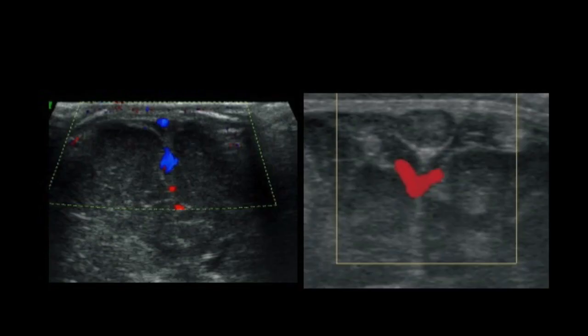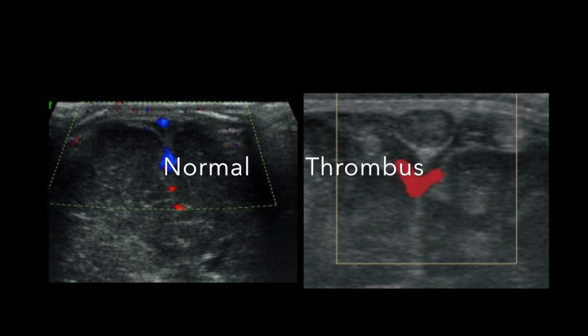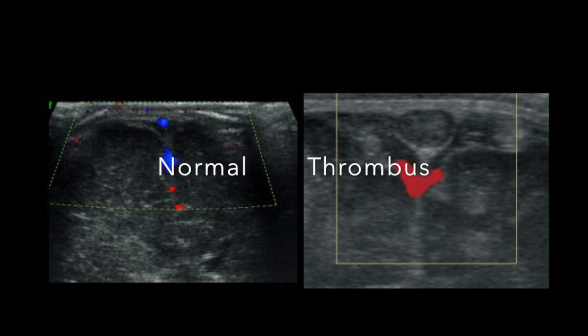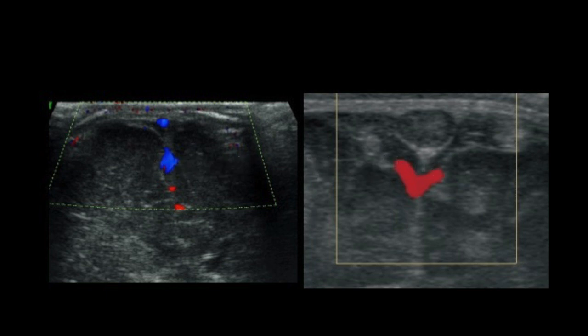This is a comparison of normal to abnormal, where on your left side you see a beautifully filling normal superior sagittal sinus, which is thrombosed in the image to your right side.